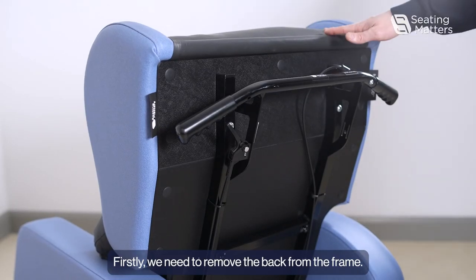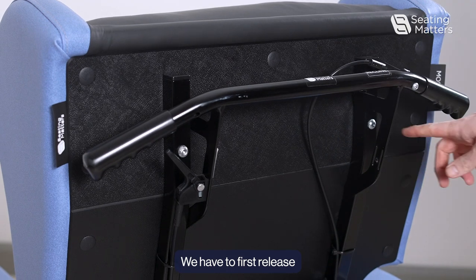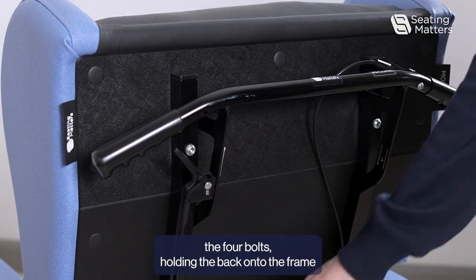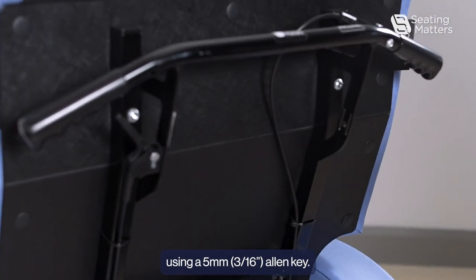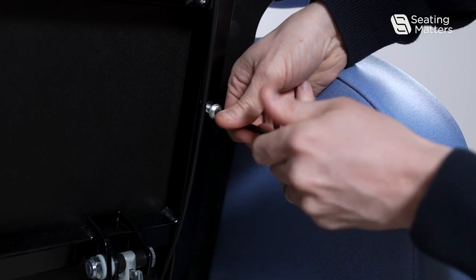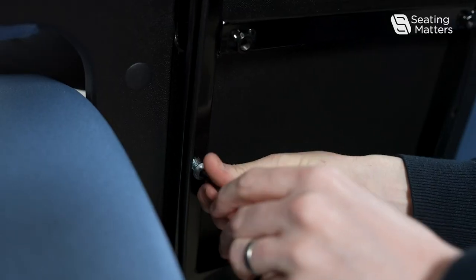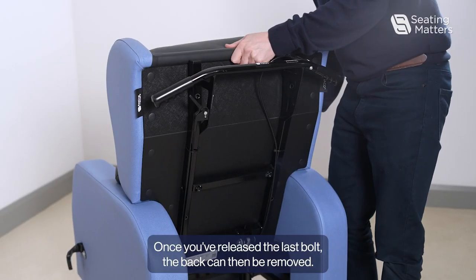Firstly, we need to remove the back from the frame. We have to first release the four bolts holding the back onto the frame using a 5mm Allen key. Once you've released the last bolt, the back can then be removed.